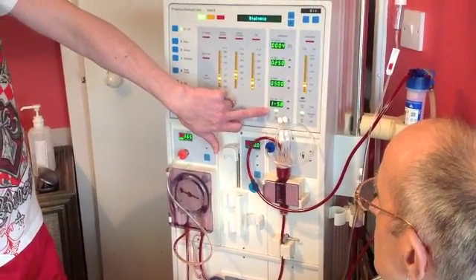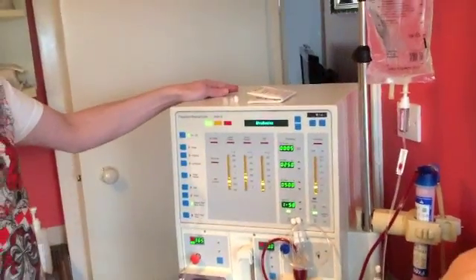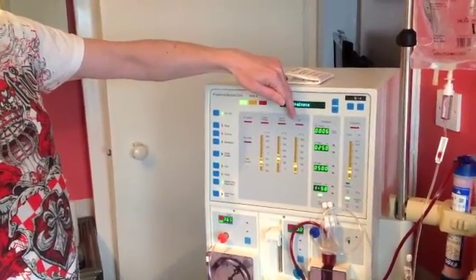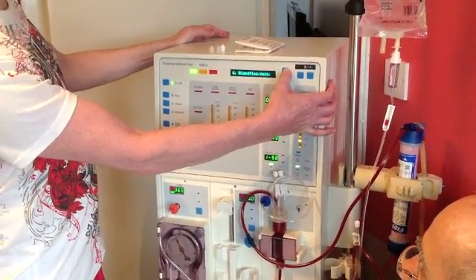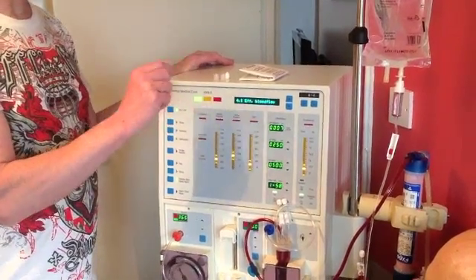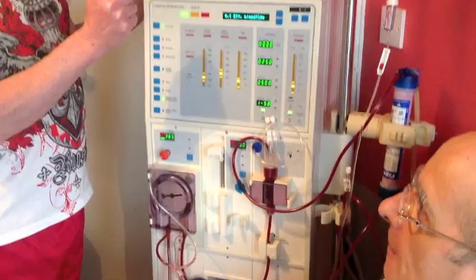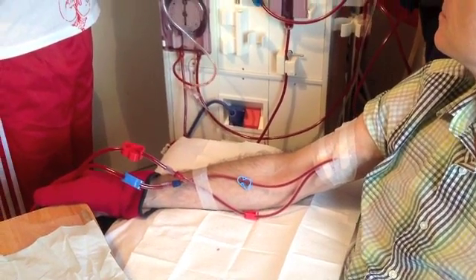As you can see, the time is now creeping down to 1:58, which means he's got one hour and 58 minutes. Normally after 30 minutes I will record the rest of the figures — his venous pressure, TMP, and also on here you will have a flow to do. Move it up to number four which is blood flow calculation, confirm effective blood flow — and he's on 326 millilitres. That's a little bit lower for Alan. It can range from 318 to about 333 for Alan. If it's on 330 it's going to be a very good one; on the 320s it's a medium one; if it's down to 318, it's not so good. But every day is different depending on how the needles have worked.